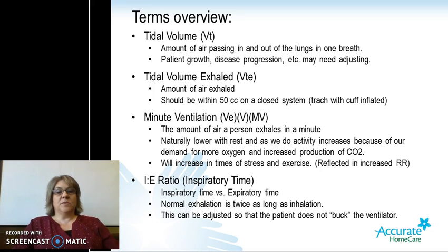Here are some of the terms that are associated with ventilators. The first one is tidal volume. Tidal volume is the amount of air that passes in and out of the lungs in one breath. As our patients grow, or as their disease progression either gets better or even worse, we may need to adjust this number.